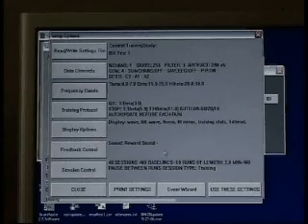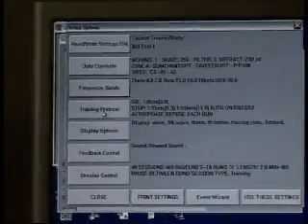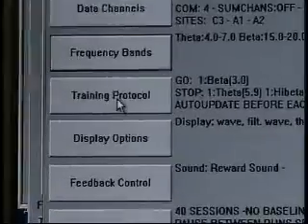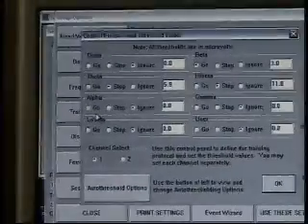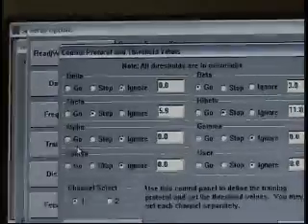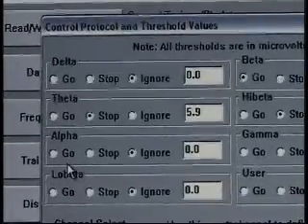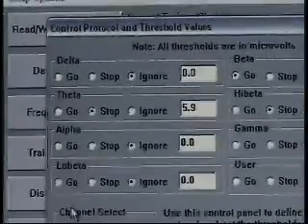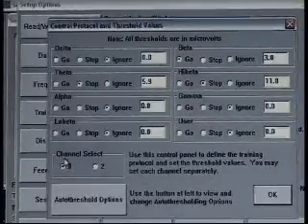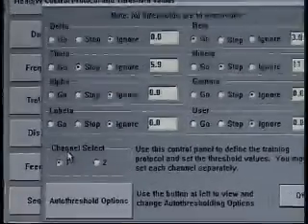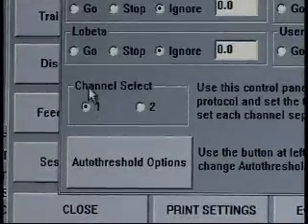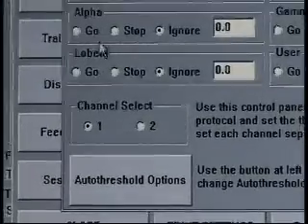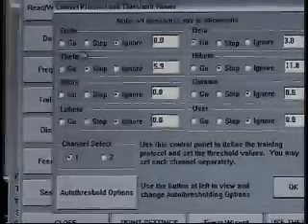The next step as we scroll down below frequency band is training protocol. As I click training protocol, I get yet another control box. This is giving me what the protocol for channel 1 is. As I scroll down slightly, I see a channel select 1 and 2. Each of these panels are independent, but we're going to start with channel 1 for now.